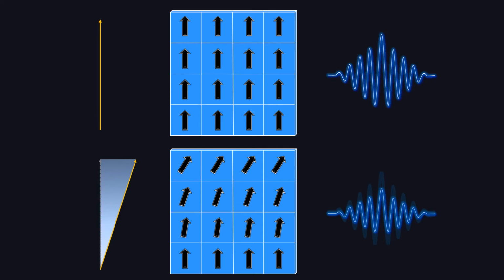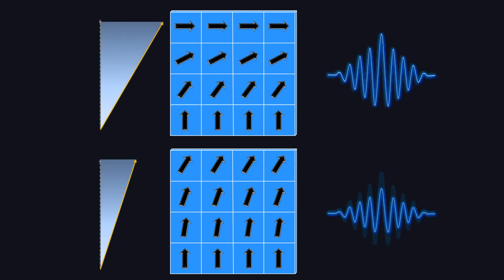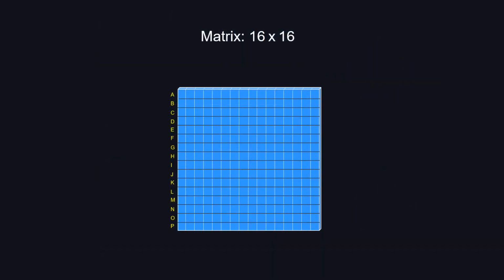If you use the entire group to generate signal, the signal will decrease because they are not in phase. When you apply another gradient that's even stronger, you will induce even greater phase shift. As a group, you're going to experience even more signal loss. So the stronger the gradient, the stronger the signal loss you will induce.